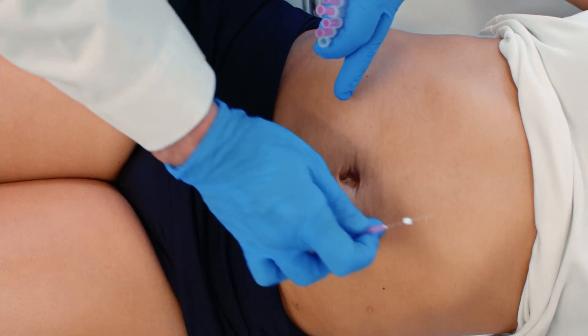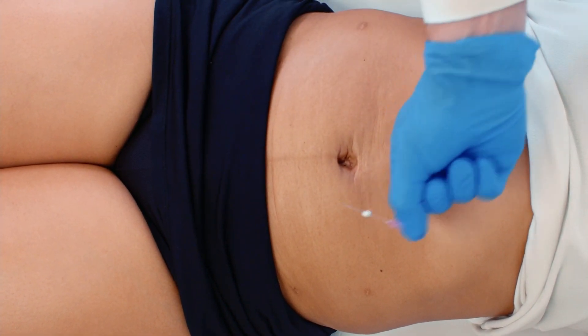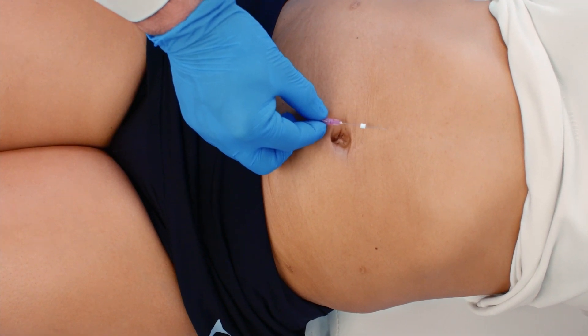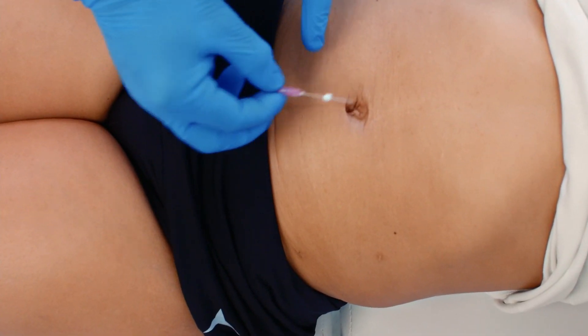In this case, we're just going to provide support to this general area and stimulate collagen. So it's not as important if I put the threads in this way, if I go from the top down, or if I make a circular fashion. What we're going to do is a meshwork — four or five threads this way, also that direction, and then we'll come back across and support those threads in a crosswise fashion.